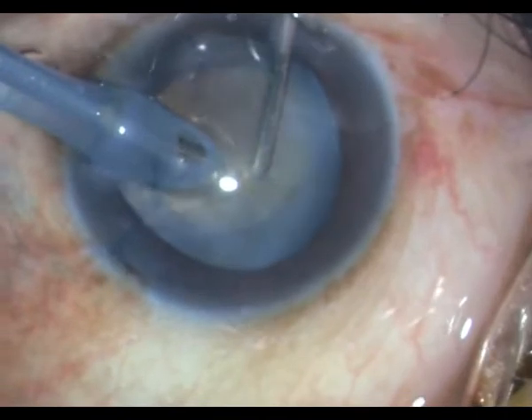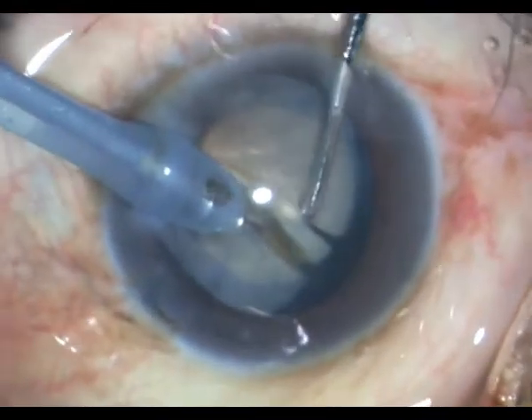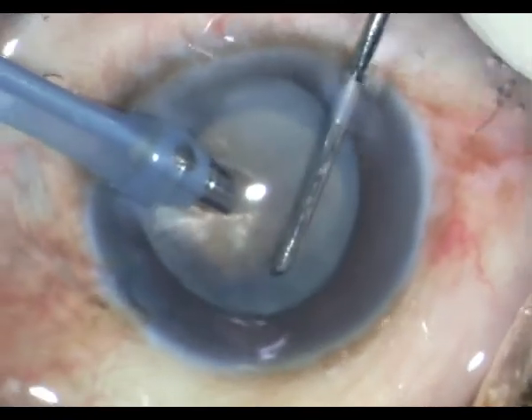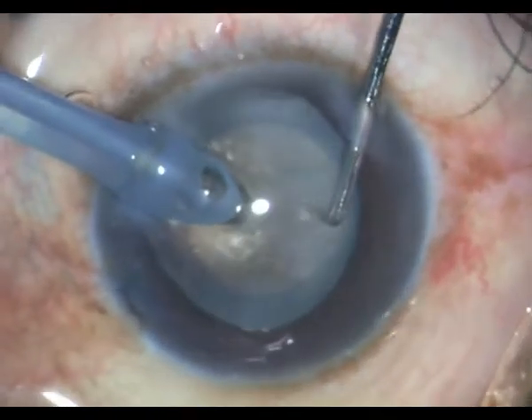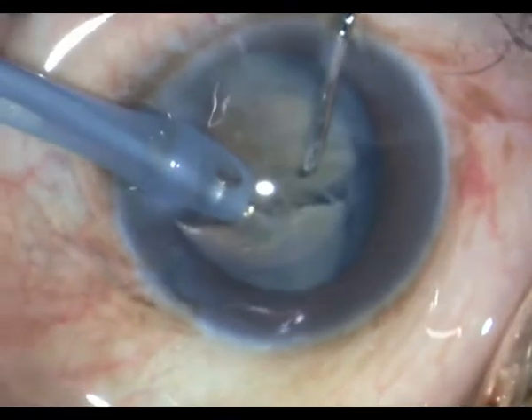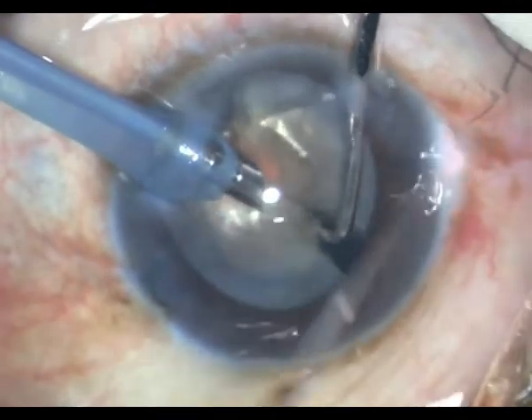With my FACO probe in my right hand and the sharp chopper in my left hand, I perform the woodcutter's chopping technique, wherein I go with continuous FACO within the center of the nucleus, go with the sharp chopper to the mid-periphery, dig deep, turn on the FACO power, come towards the chopper and laterally separate.